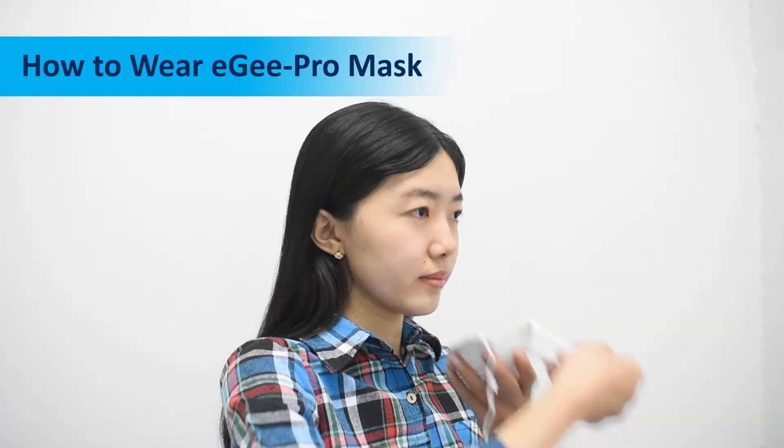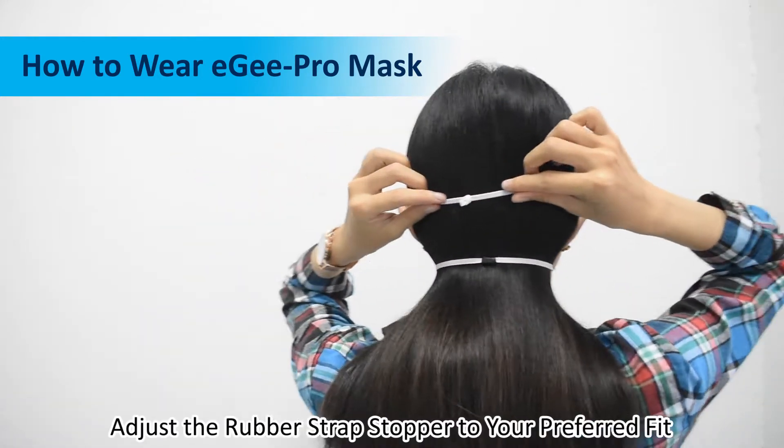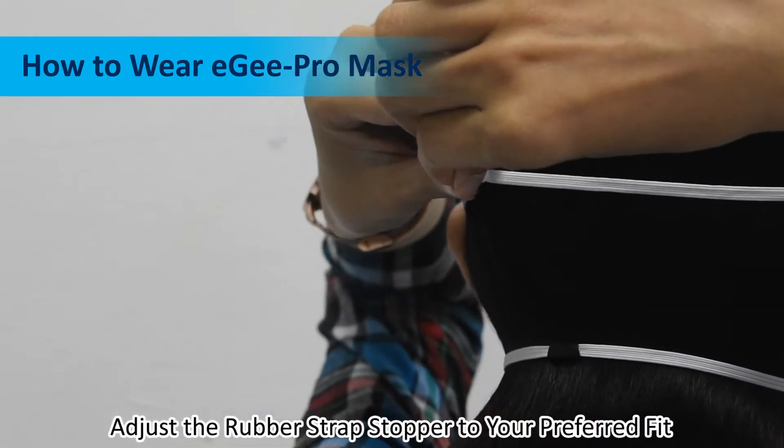How to wear EG Pro mask. Pull the rubber strap of the mask over your head. Adjust the rubber strap stopper to your preferred fit.